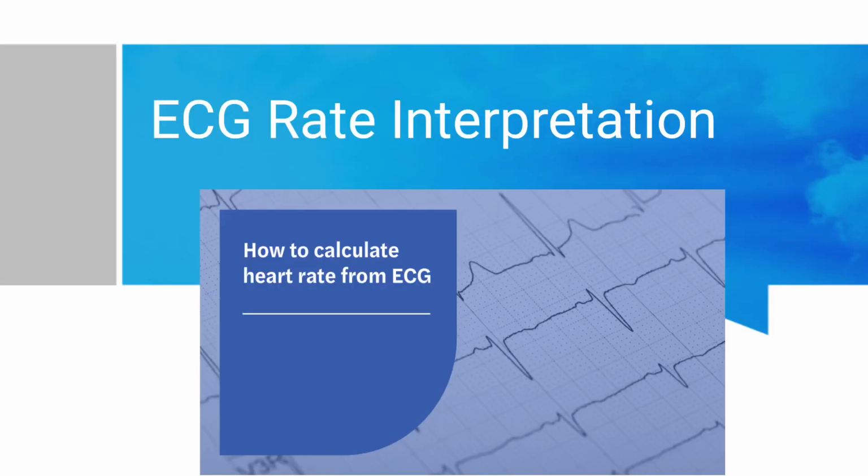Hey friends, in this series of ECG Basics, today I will talk about ECG rate interpretation.